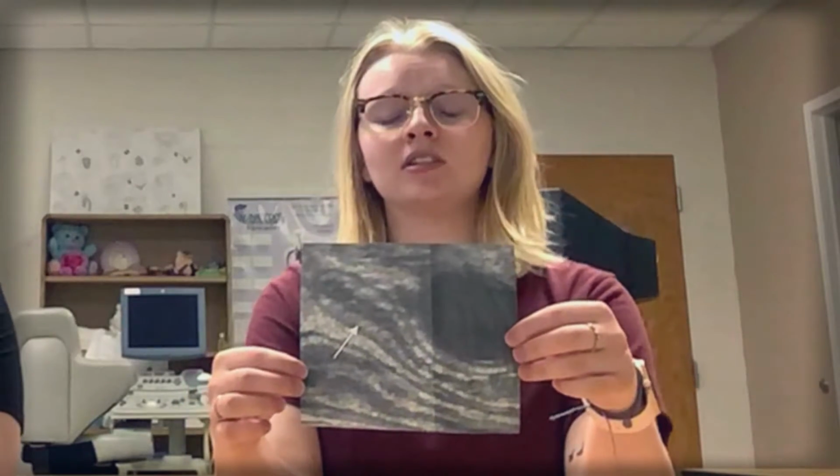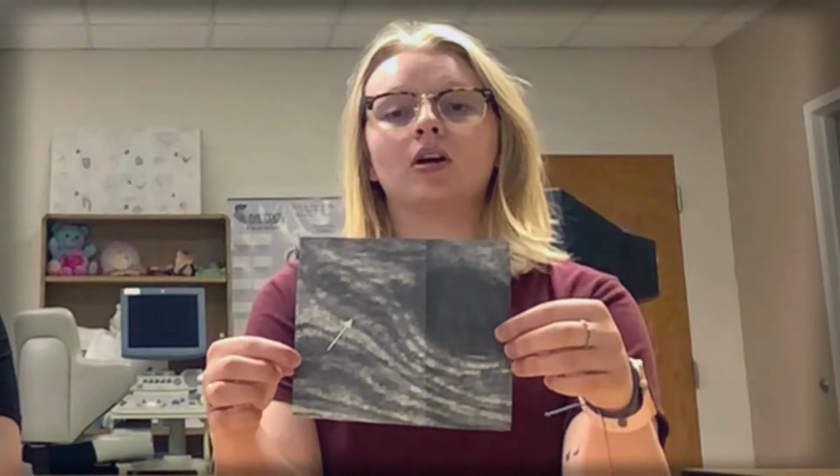It can be difficult to see on ultrasound, but when scanning, you should use a small parts probe and scan in the right lower quadrant at McBurney's point. McBurney's point is if you were to stretch out your hand and place your thumb on your iliac and your pointer on your belly button, it would be right there in the middle. So it's following the ascending colon and the right iliac, so you just want to scan in the right lower quadrant to look for it.